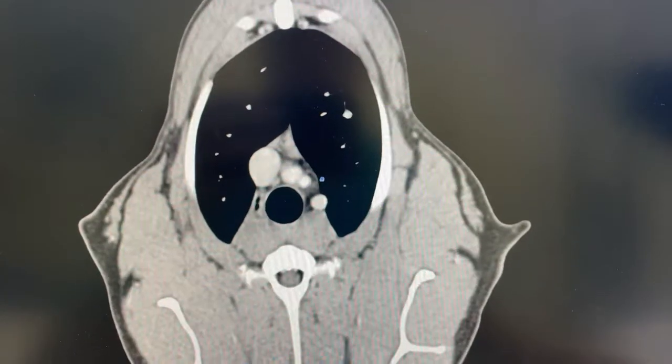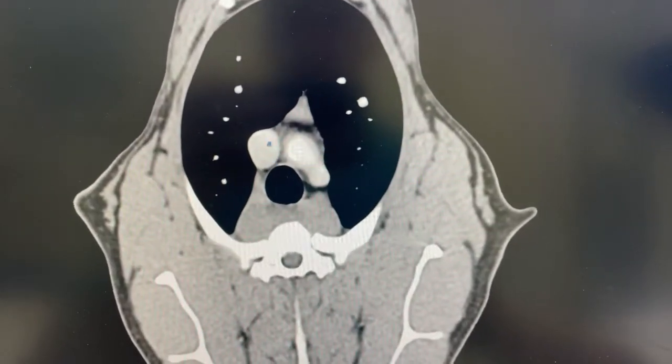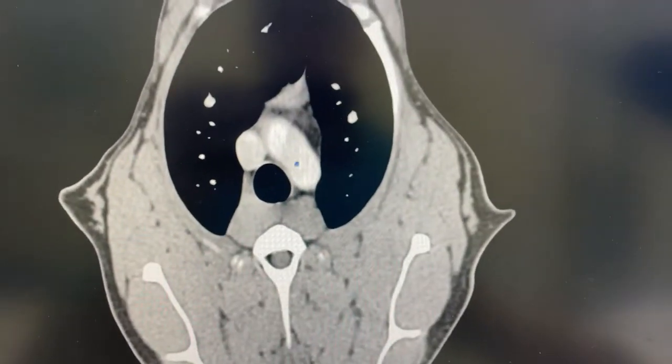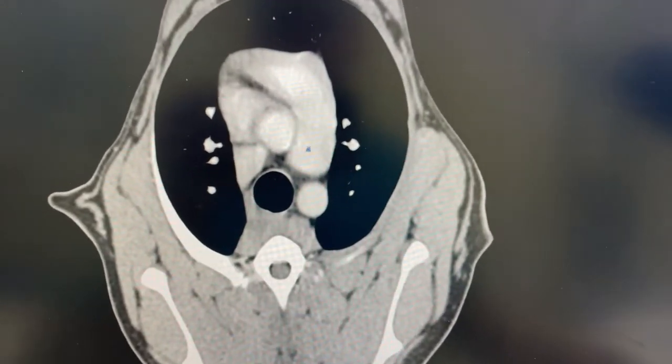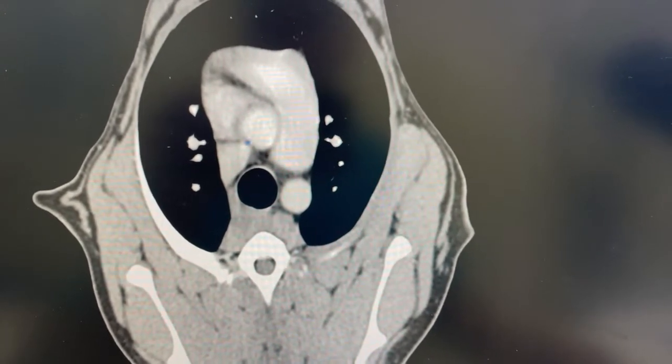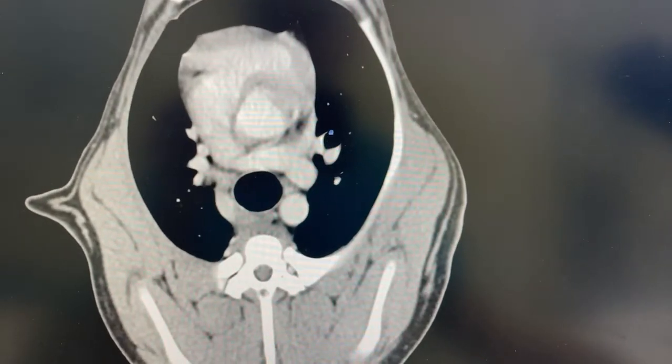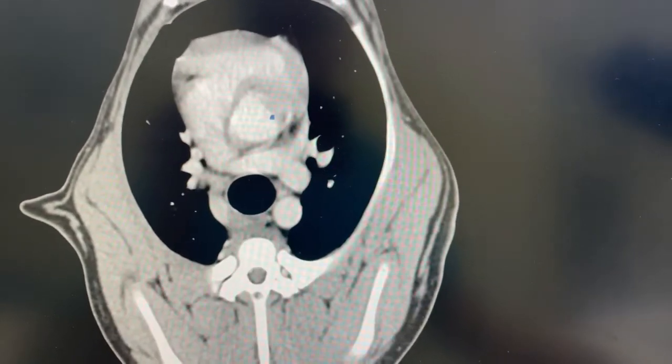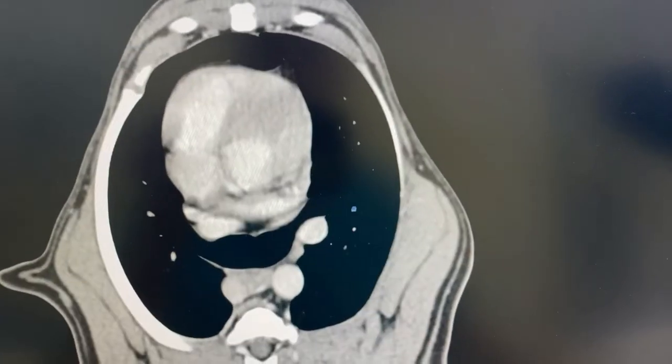This is the CT scan of the patient. As I head caudally here, you can see a large vena cava there. You start seeing the aortic root right there. The trachea is sitting there. That's the right outflow tract, so right ventricle, right outflow tract. And that's the aorta coming up right down the middle there. And then you can get a hint of the aortic valve right there, triangular shaped tricuspid valve.